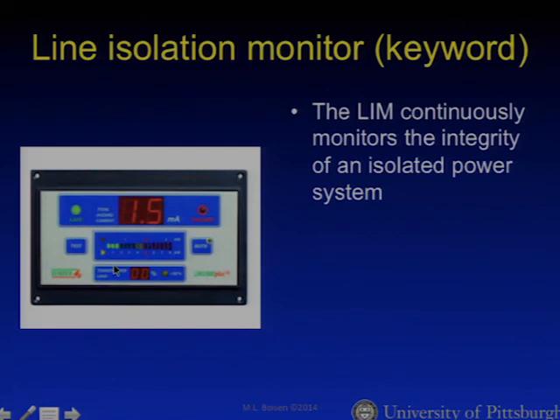So this continuously monitors the degree of isolation, and when it detects a potential for leakage current to occur, it will alarm. And when it does so, assuming it's safe to do so, you probably want to unplug the last piece of equipment that was plugged in the operating room.